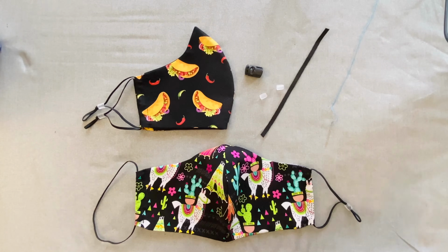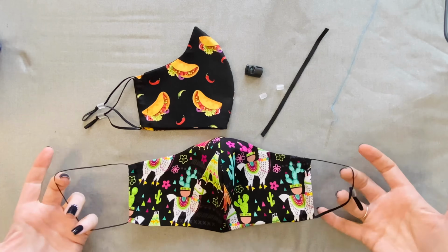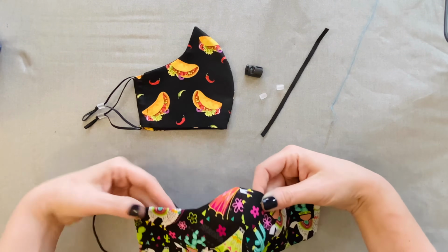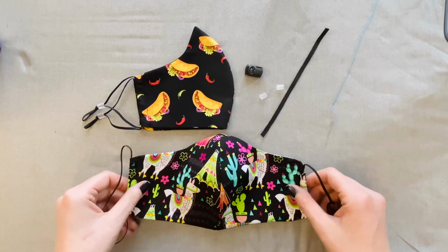So the biggest thing is making sure that the elastic is adjustable. Because when you try to get it exactly right on the first try and you haven't seen the kid, you're mailing the mask to them, it's really hard. It's hard to make sure you get the fit correct. And if the fit's not correct, they're definitely not going to keep it on. So anyway, we've got this thin elastic. This is a mask that's done. This is actually an adult small, just because, like I said, my nephew's turning 12, so he's not a little kid anymore.